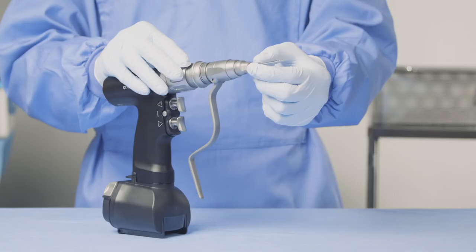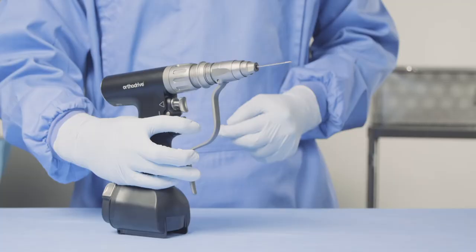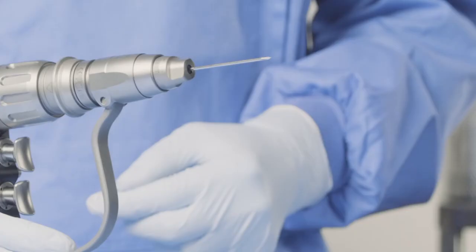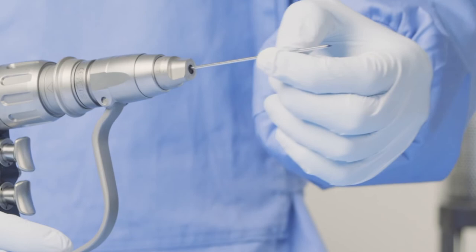Once in place, you can turn the tool off safe mode and into drilling mode, pull back on the lever to lock the wire into place, and run the wire like so. Once done with the wire, you can make adjustments by simply releasing the lever, which will allow the wire to move freely once again. Once completely finished and you're happy with your wire placement, you can slide the wire out of the tool, like so.